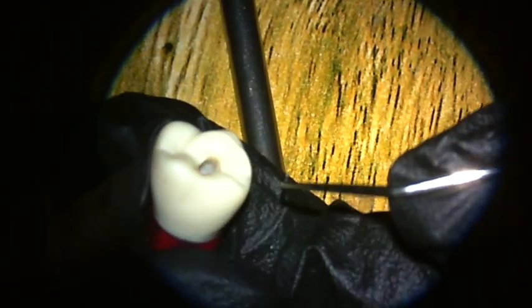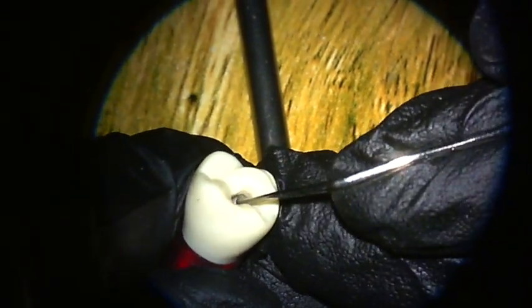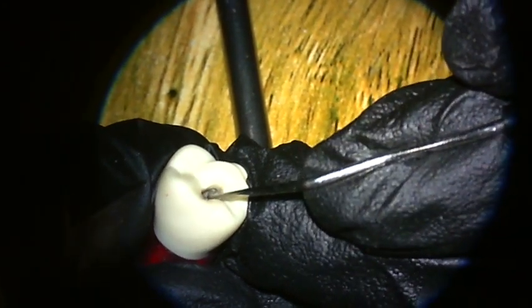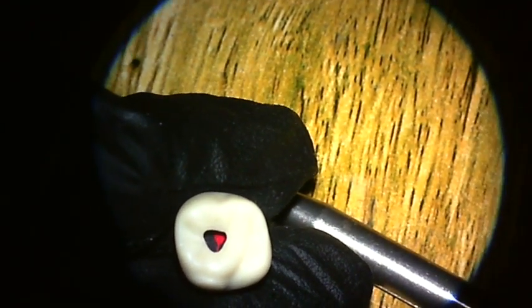Usually it's above the orifices, most likely the palatal orifice and more distally. All right. Ideally, there shouldn't be any pulp horn remaining.